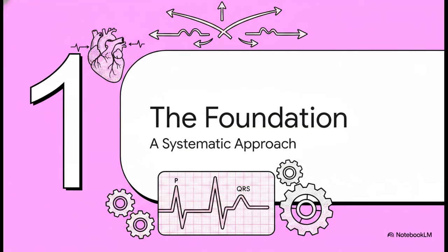All right, first things first. Before we can even think about making a diagnosis, our analysis has to be grounded in a consistent, repeatable framework. This methodical approach is an absolute prerequisite for getting to an accurate interpretation. You just can't skip it.